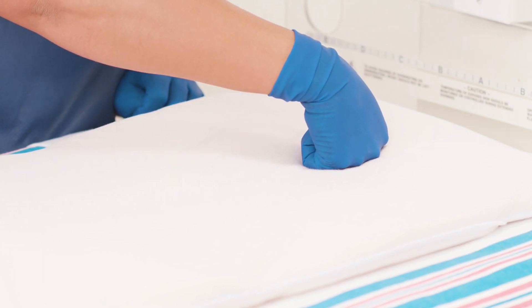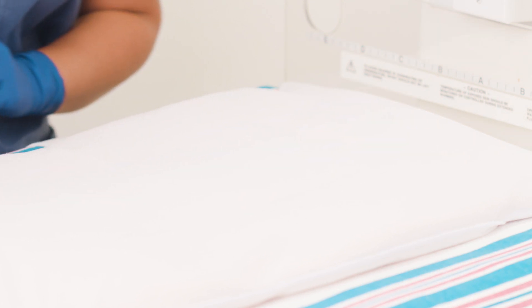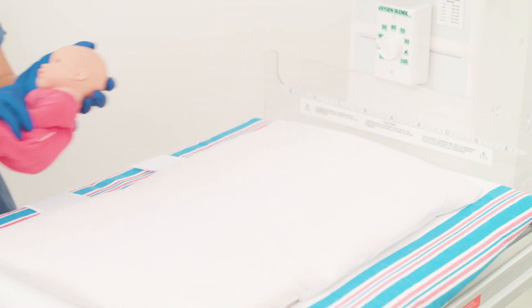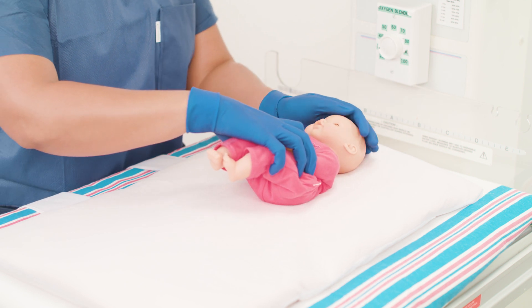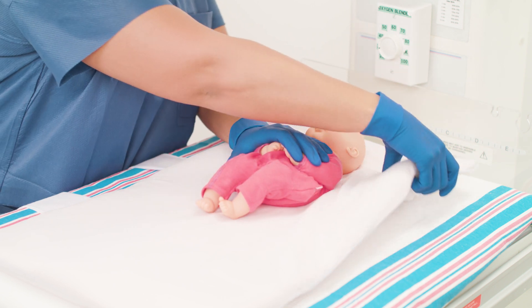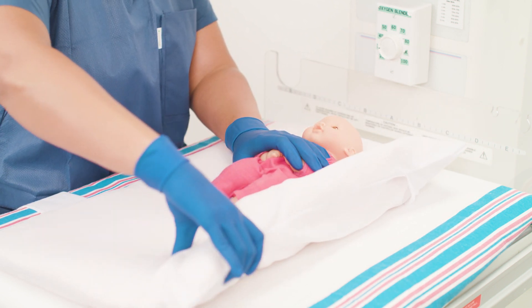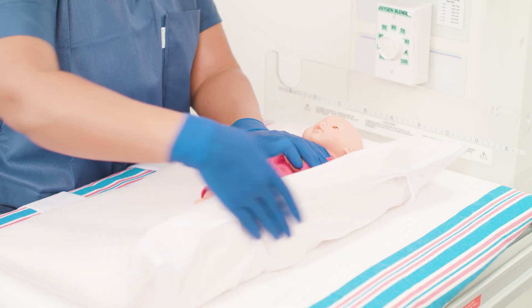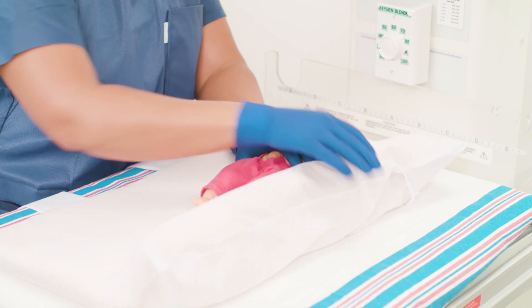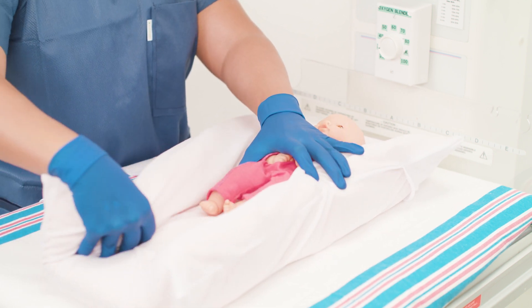Make an indentation for the baby's head towards the top of the positioner. Place the neonate in the center of the positioner horizontally and towards the top of the positioner vertically. Begin molding the positioner around the baby's body, keeping one hand between the positioner and the infant. Start from the side away from you, followed by the side closer to you. The positioner should conform closely to the baby's body.